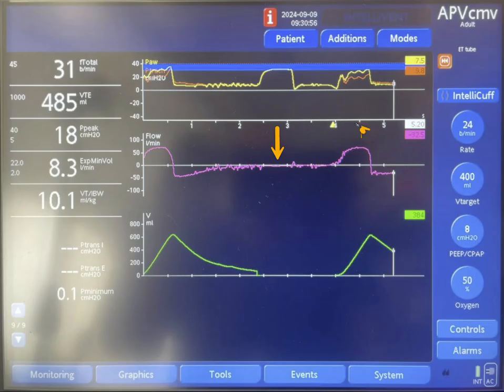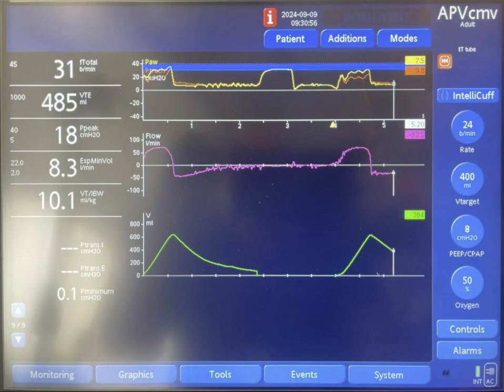The third breath is initiated by a negative deflection by the patient. Pressure goes up to 30 centimeters, with similar flow and similar tidal volume to the first breath.